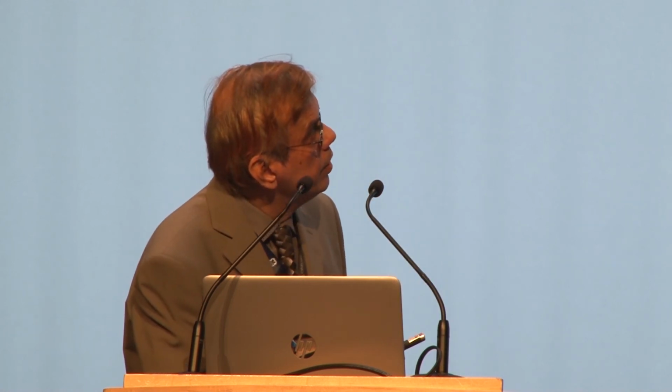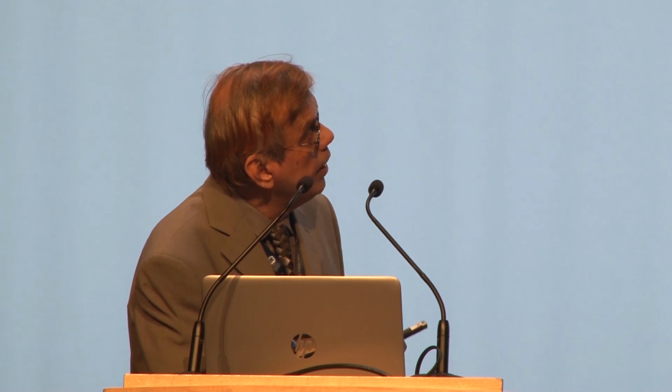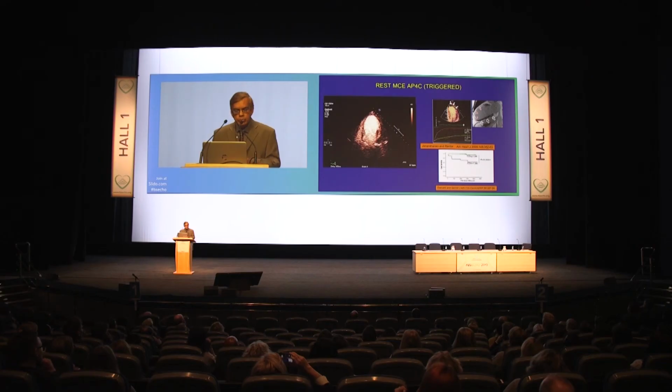So we did a stress echo, dobutamine. Now, rest, intermediate, peak. Now, I couldn't make any head or tail of what's going on in the septum. The septum hasn't moved or shifted from baseline to peak. And I couldn't say whether there's viability or no viability. Now, as I've said, we do contrast in all of these patients. So this is the rest contrast of the patient. So this is the rest study.